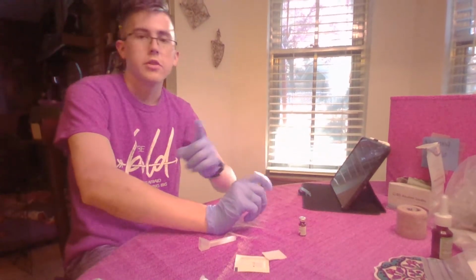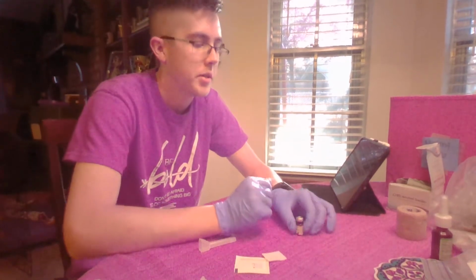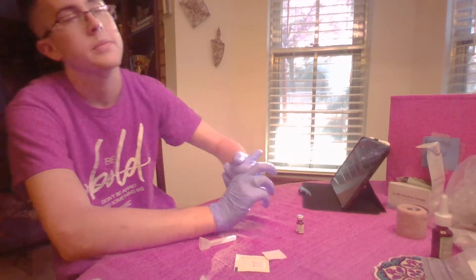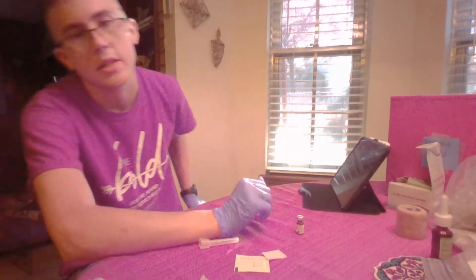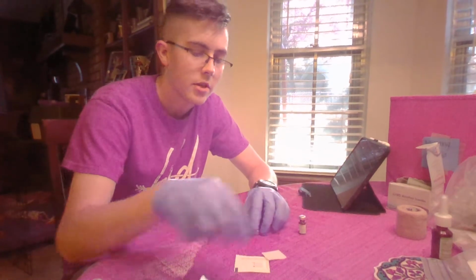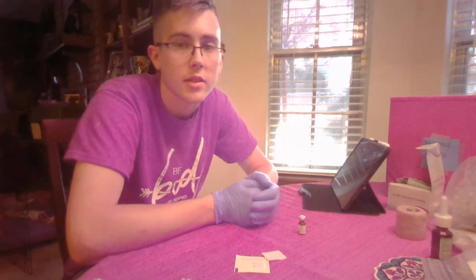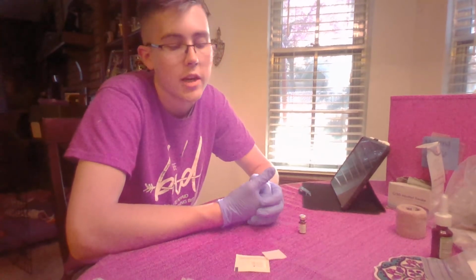Start off by making sure that my patient is being ventilated adequately. Go over and ask them if they have any known allergies, explain the procedure. So we are going to be administering a medication into your nasal passage. You may feel some discomfort, but this is intended for the medication to be inhaled.